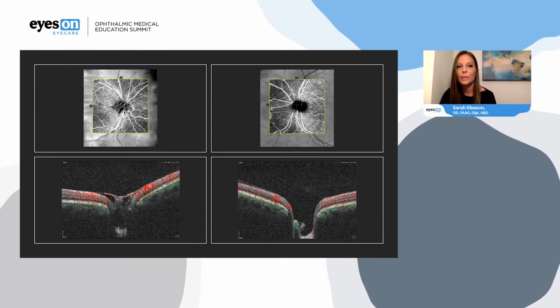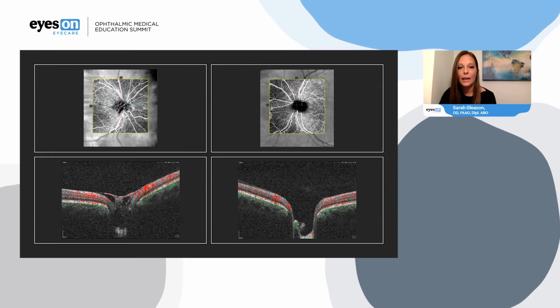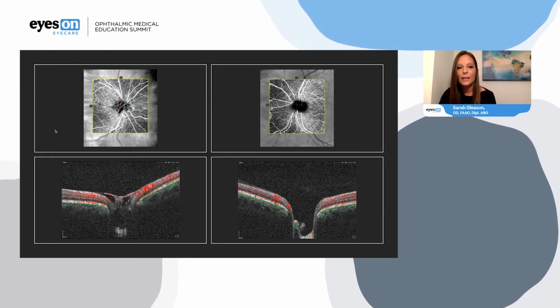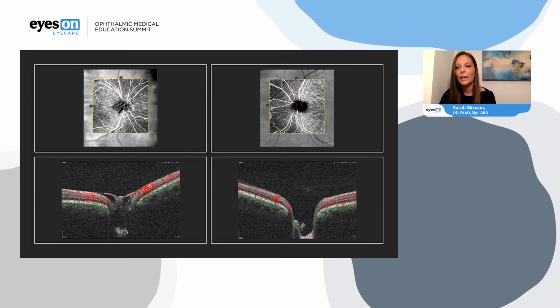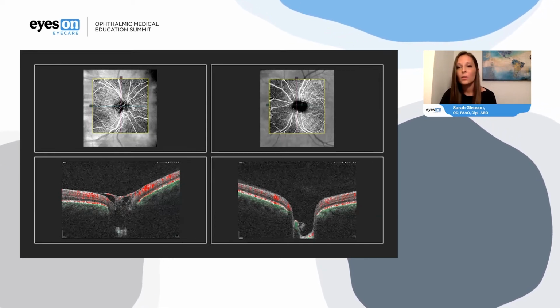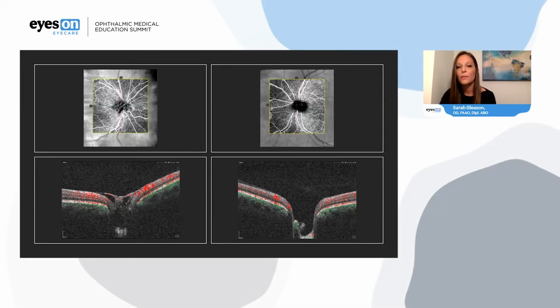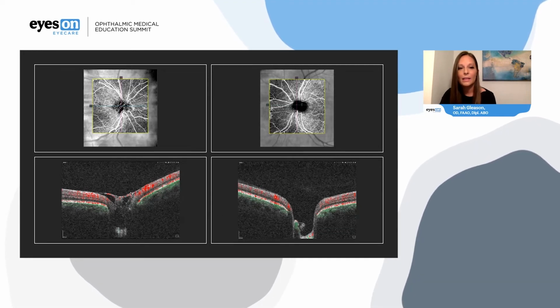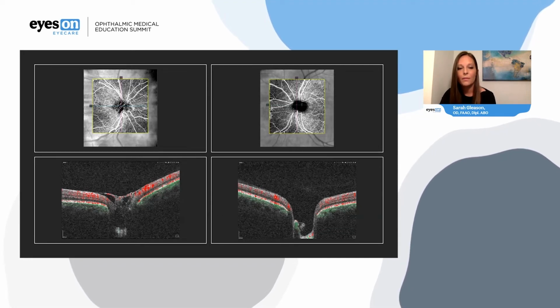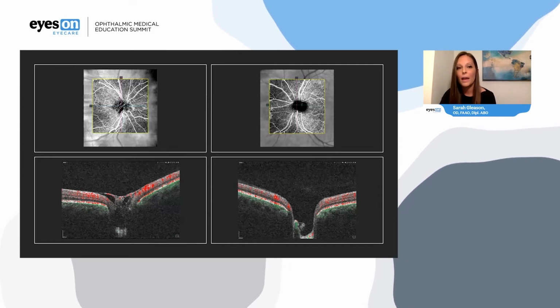And on the right nerve, you can really see how many blood vessels are there and how significant that neovascularization is. If you look at the bottom of the slide, we have our tomograms, and this indicates areas of red, which indicate areas of blood flow. Remember, our OCTA is taking multiple B scans over and over again and looking for movement in the retina, and that movement is going to be blood flow. So you can even see within this neovascular net, over top of the optic nerve, she has blood flow. This is just a great image of what's going on, both on the en face and a tomogram through that area of proliferation.